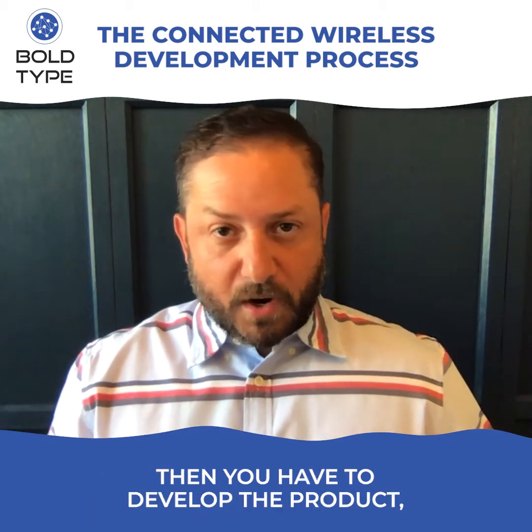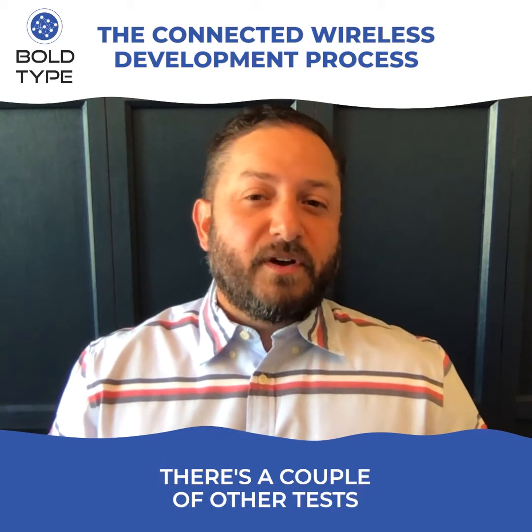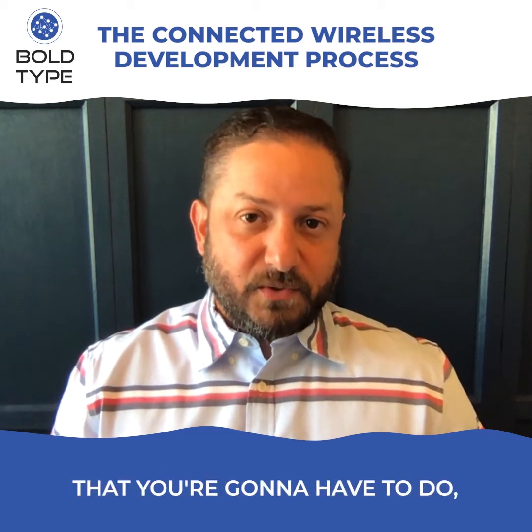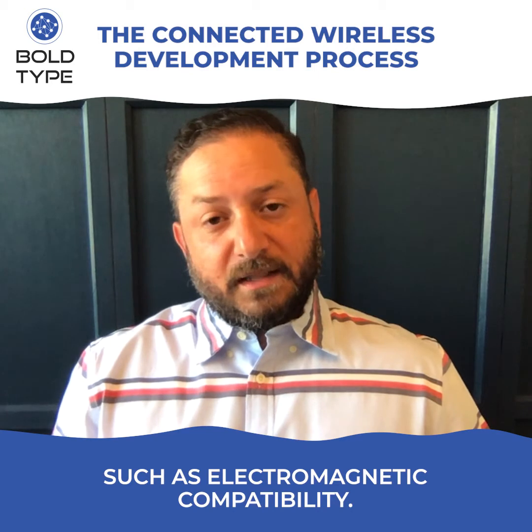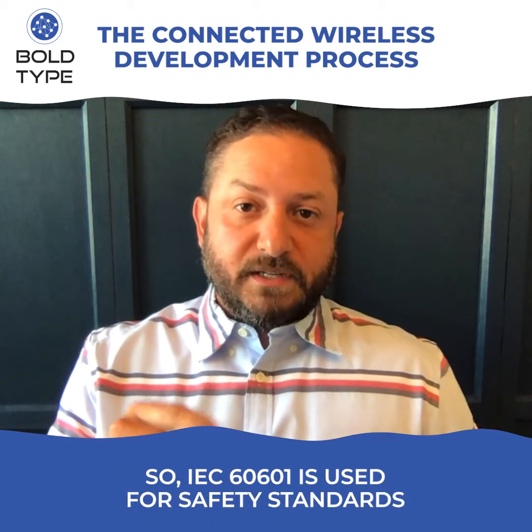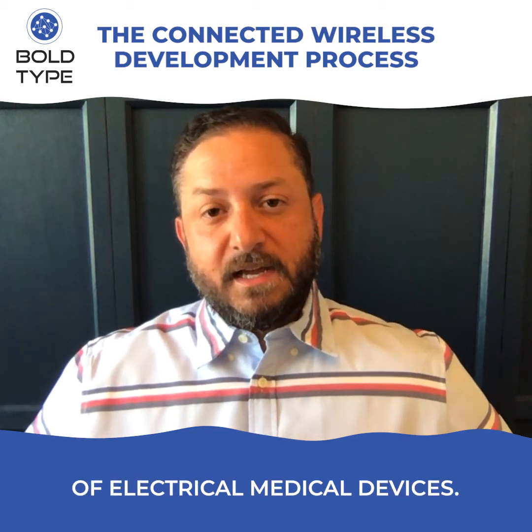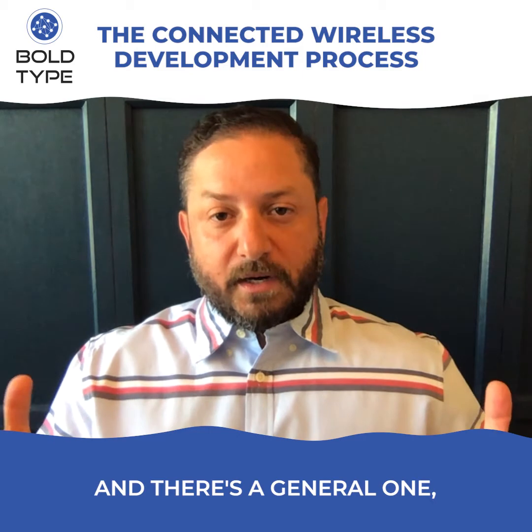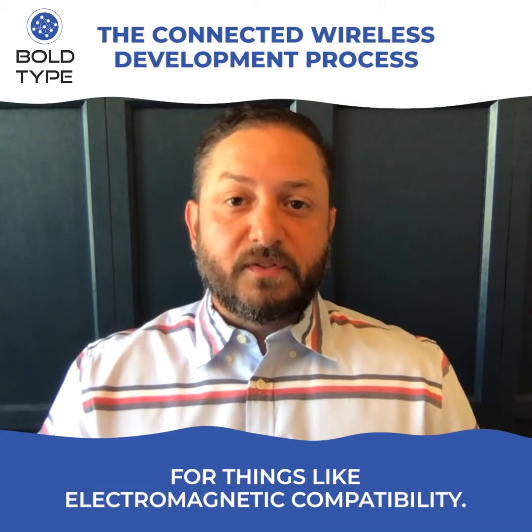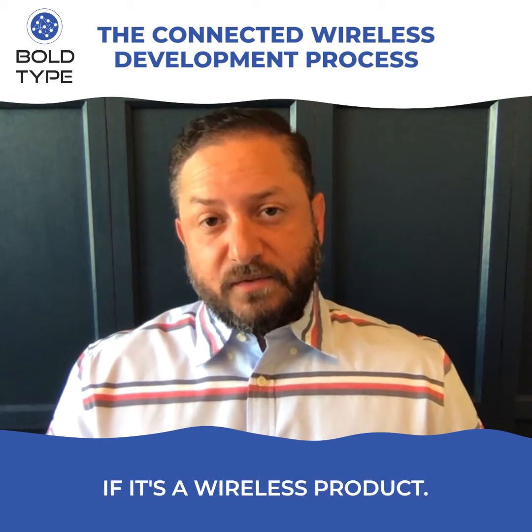Then you have to develop the product, so that's normal. Importantly, during the verification test, there's a couple of other tests that you're going to have to do, such as electromagnetic compatibility. So IEC 60601 is used for safety standards of electrical medical devices, and there's a general one, but there's also some specific ones for things like electromagnetic compatibility. So that's an extra test that you would have to do if it's a wireless product.